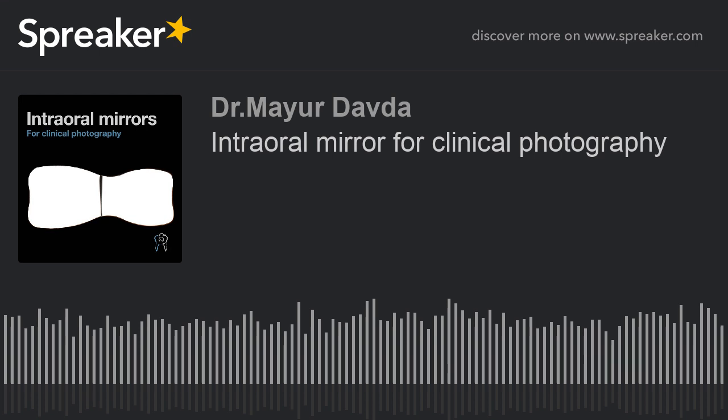The ultimate criterion for a good mirror, however, is that your mirror has to be front surface coated and not behind surface coated. That is because if your mirror is behind surface coated, apart from the actual reflection that you're going to get of your subject, you will also get a halo of your subject, which is also called a ghost image.